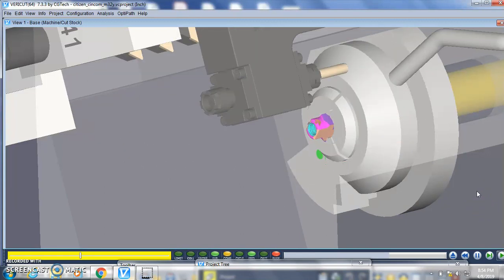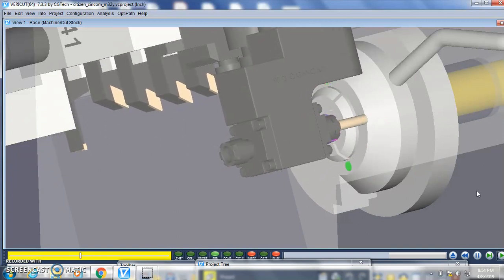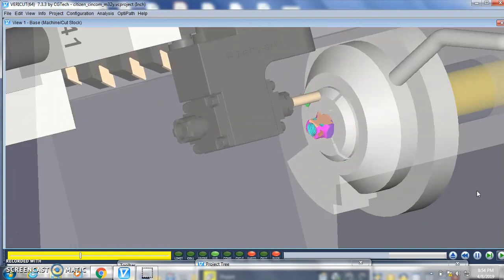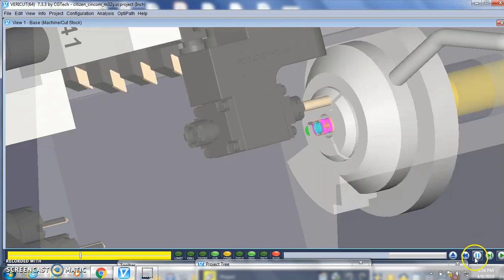One critical aspect of multi-channel programming on a multi-axis machine is how robust the post is. These simulation packages are designed such that when you post the tool path out to the control, it will simulate exactly what will happen on the real CNC machine.